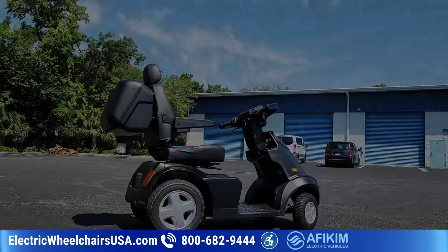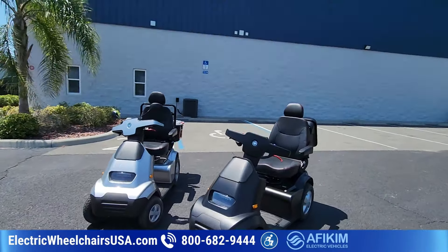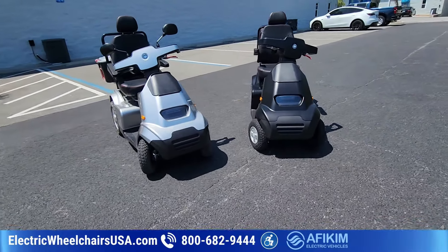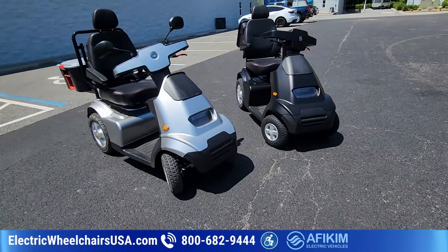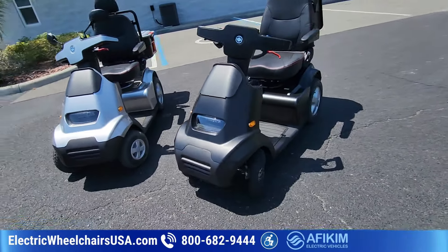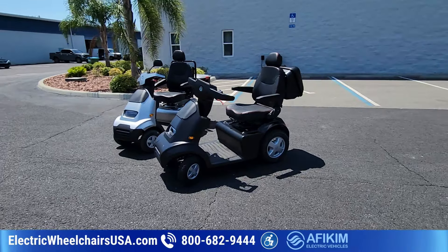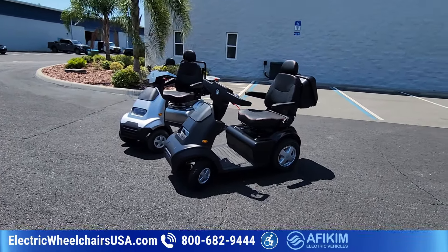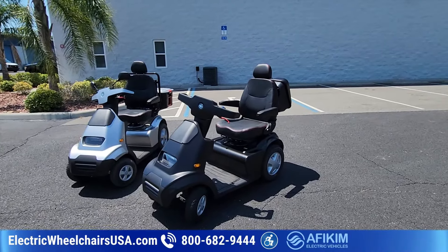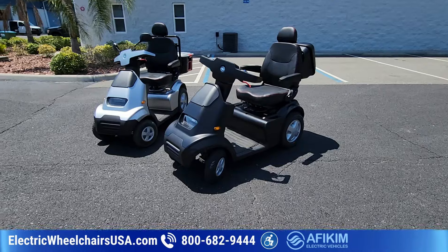Let's get into some of these features. The battery range on these scooters — the standard range is 37 miles on a single charge, which is plenty to get through an entire day. For people who want more range, we now offer a lithium battery upgrade. There are four different choices of lithium batteries, and the top choice will give you an impressive 150 miles on a single charge, which is unheard of.